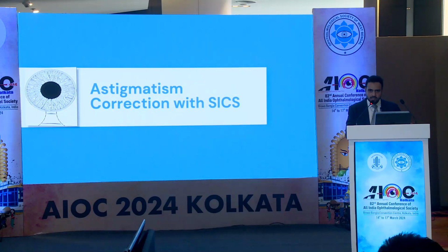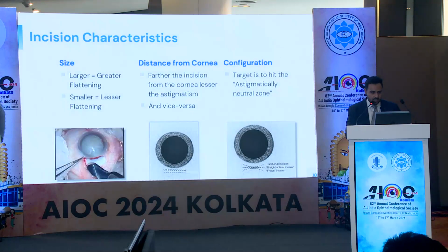So how do we correct the astigmatism in SICS? Mainly, incision characteristics are very important. The size of the incision: the larger the incision, the more the astigmatism can be corrected, and the more astigmatism is caused also. So the smaller the incision, the lesser the flattening and lesser astigmatism caused. The other thing is the distance from the cornea: the farther the incision from the cornea, the lesser the astigmatism, and vice versa. The closer the incision, the more the astigmatism.